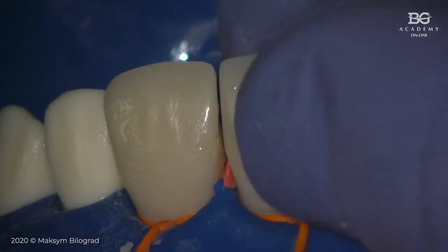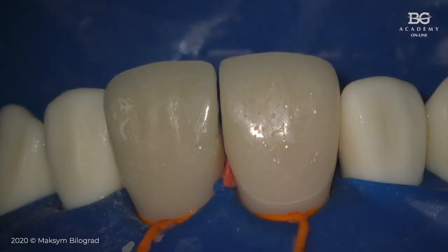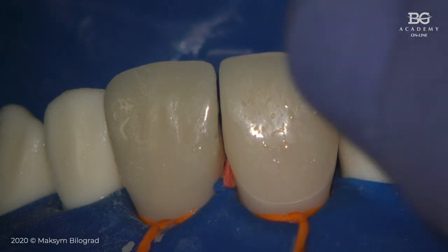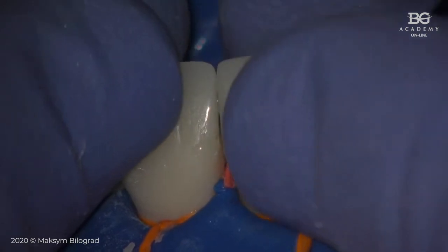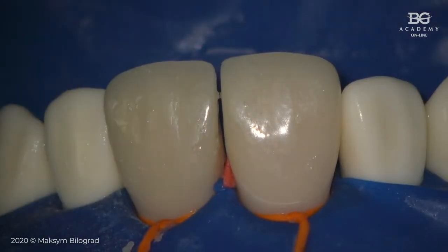Okay, and then I will do another try-in. In my case, you see that I have a gap because the phantom teeth are mobile. In the patient case, there will not be such a gap, but let's assume there will still be problems with interproximal contact, but you have your wedge.